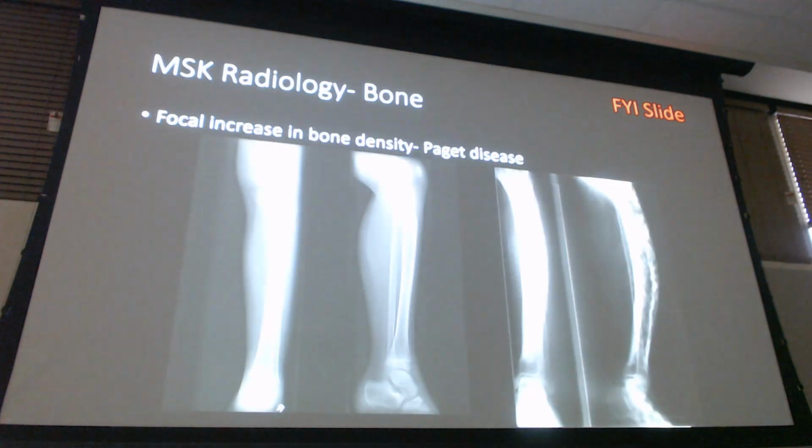And what you're gonna see is this. This is your Paget's disease, okay? So how do I know that's what's going on here? Well, there's three key factors to Paget's disease. One, you got that thickened cortex over here. Again, normal, abnormal. Thickened cortex, and then a more prominent trabecular pattern within the bone compared to the normal side. Everybody see that? Really look how thick that is. Even if you just compare it to your fibula right behind here, you see how thick that cortex is, and then that more prominent trabecular pattern.